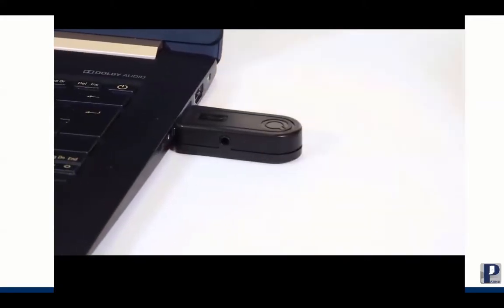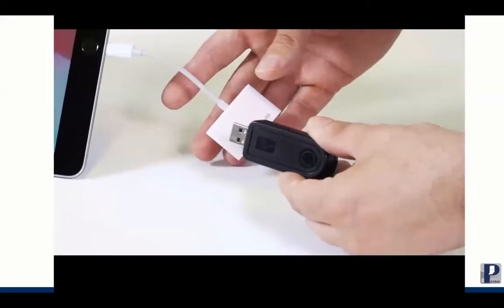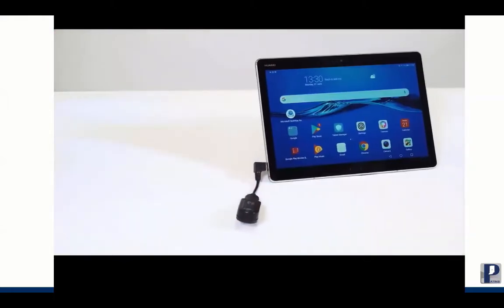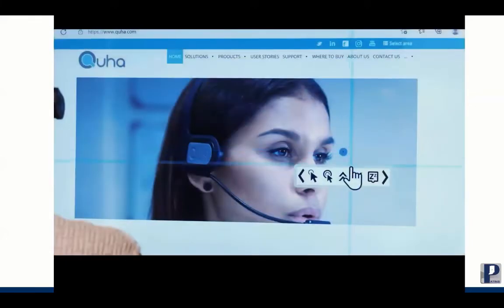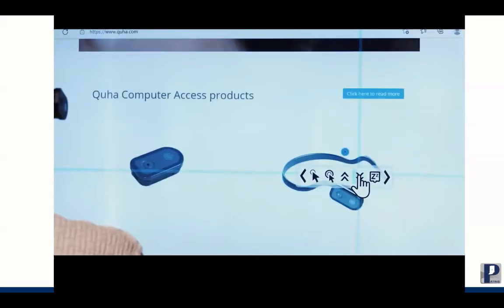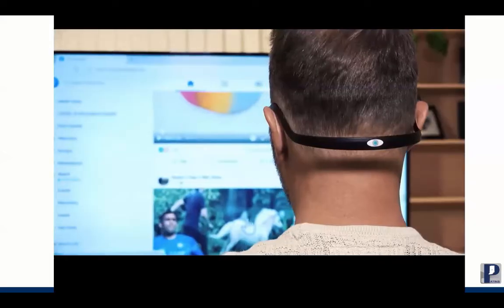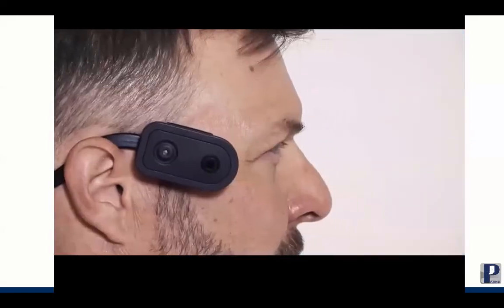Just plug in the USB receiver and turn Zono 2 on. You can connect it to an iPad, Android tablet, or smartphone. Zono 2 includes Quha dwell software for mouse clicking. You can also click with the Quha Sento Puff switch or with any switch. Zono 2 recognizes gestures to scroll, pause, and center. For example, activate scroll by nodding twice. Quha Zono 2 enables independent computer use without hands.